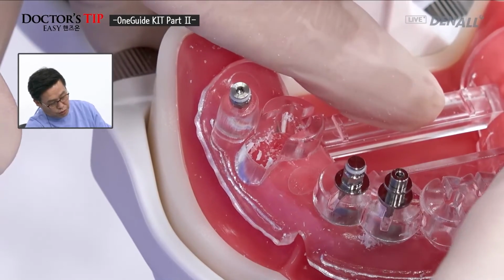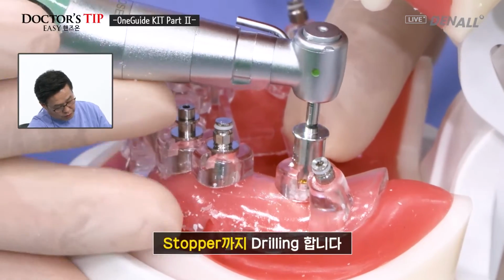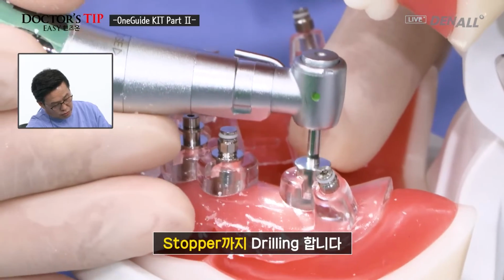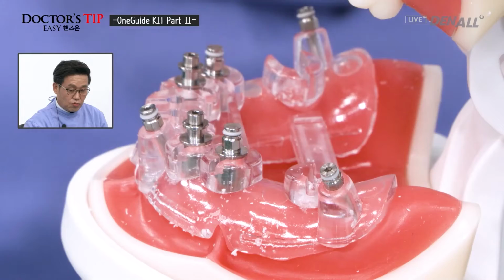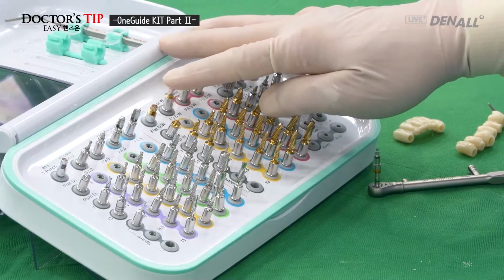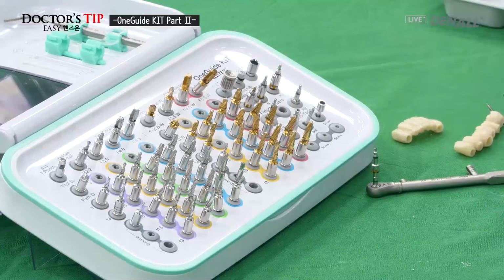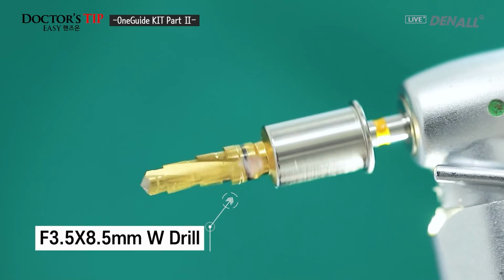On 36, this is closed type. This is the same up and down. Motion is done to do full length drilling on accurate position. Initial drilling is done, and after that, I'm going to drill 8.5 millimeter, 3.5 by 8.5 drill length. OneGuide drill is going to be chosen. It's connected.